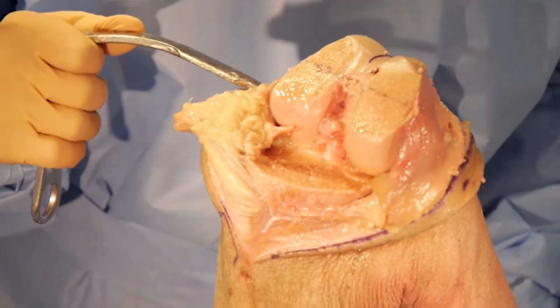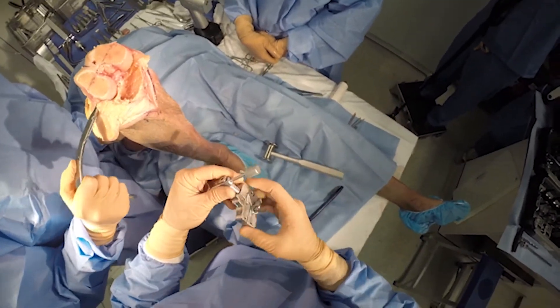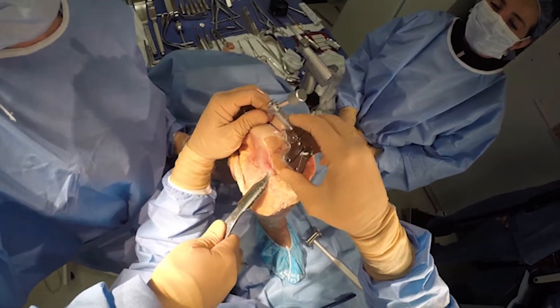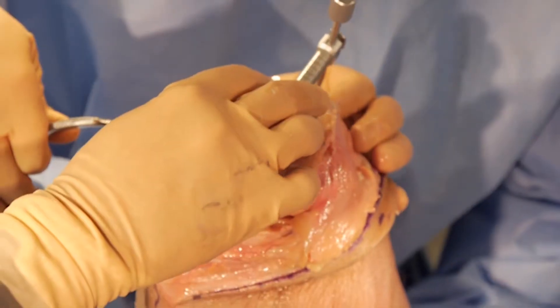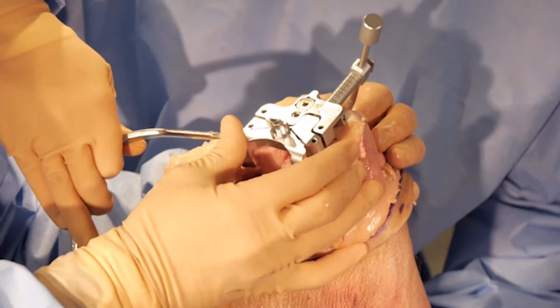Now I'll take the distal femoral sizing guide, which allows me to size both anterior and posterior as well as set my rotation and change the size of the components. You want to size off the lateral side of the distal femur — that's the highest side. If you size off the medial side, a lot of times you will end up notching on the lateral side.